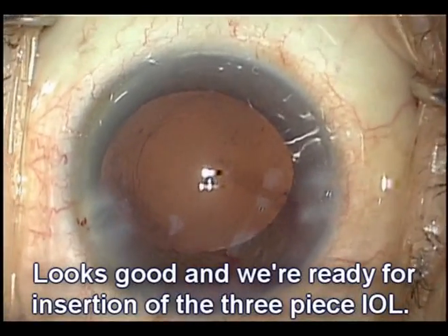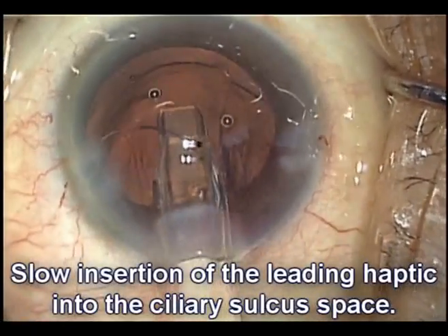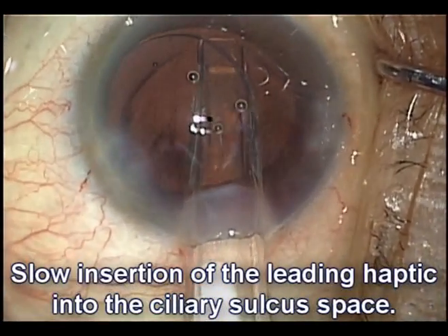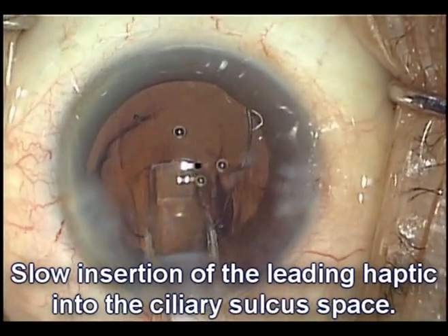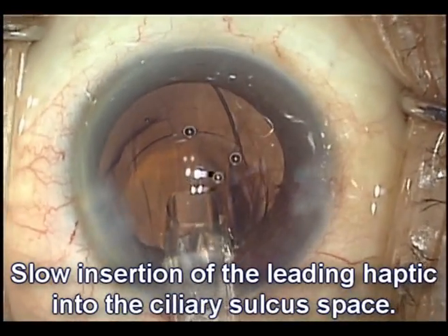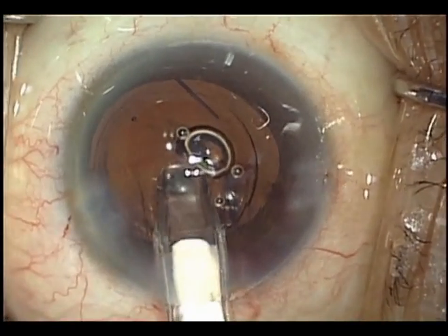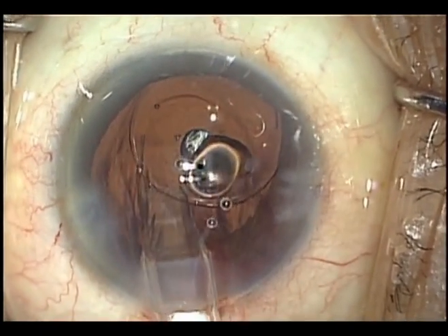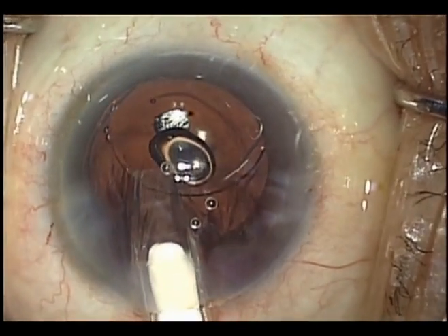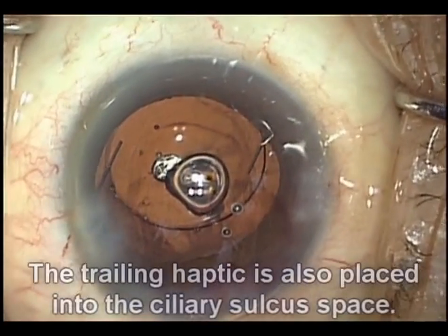Things look good and we're ready to place our new lens. Here comes the new lens — it's a three-piece lens. There's the leading haptic going into the sulcus. Here's the optic coming out — nice planar delivery of that optic. We'll advance it and get that trailing haptic in the eye as well. It's important to do this in a very gentle manner to avoid having vitreous prolapse anteriorly.